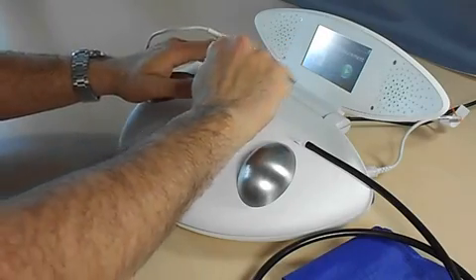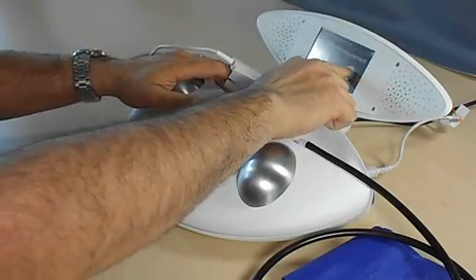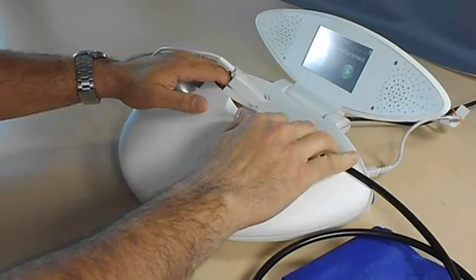Now place both hands lightly on the electrodes. Please remain relaxed during the measurement.